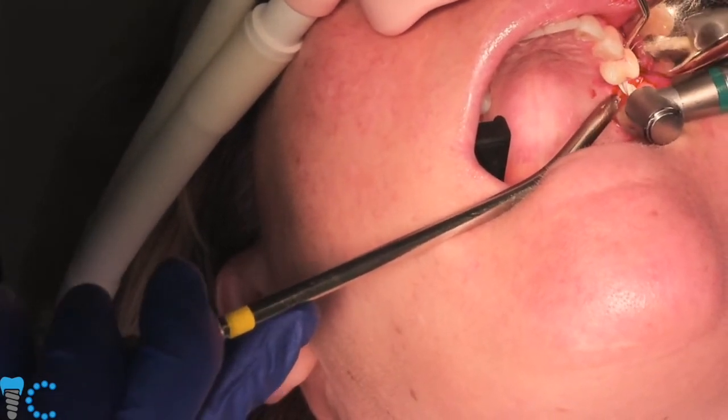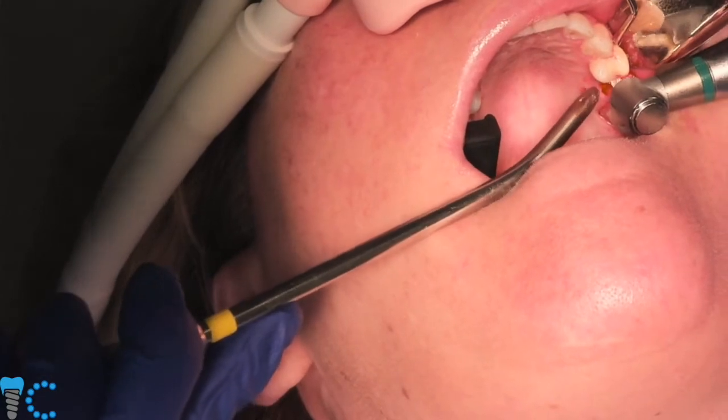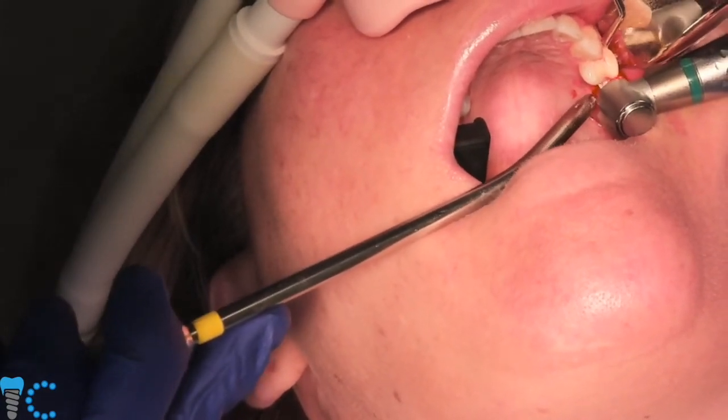You may have said this, but what are your RPM settings on your implant motor when you're doing this? I'm not telling you again.